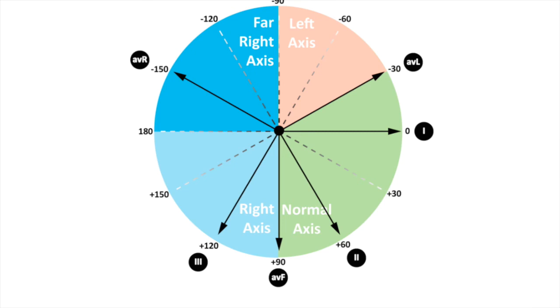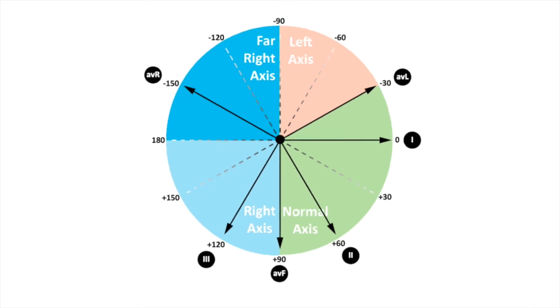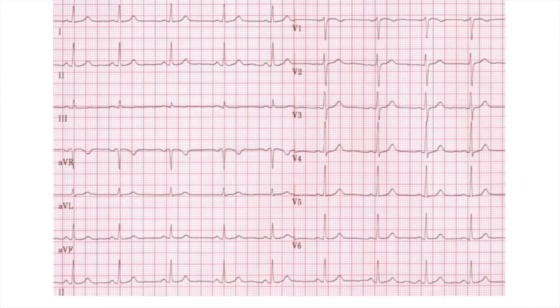In an exam, I would get too flustered and I wouldn't remember it, so I memorized the other way of doing it. Now, here's some good examples for you guys to go through. I can go through it myself with you guys now, but if you want to give it a look, I would recommend giving it a look. So, obviously, patient info, technical info. Let's say that's assumed done.